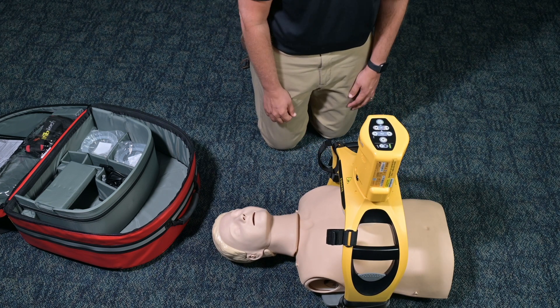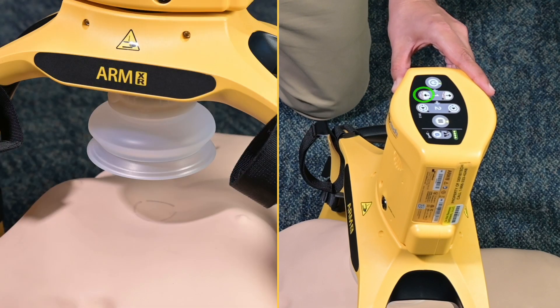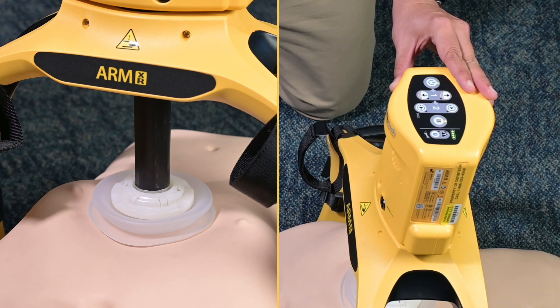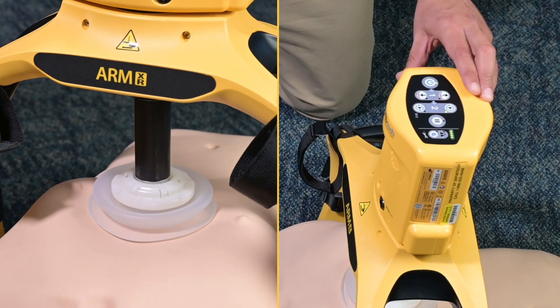Deploy the piston to the patient's chest by pressing and holding the adjust down button on the compression module. The piston will extend and automatically stop when it reaches the appropriate position. Simply press the Run Continuous or the Run with Rescue Press button to start compressions.